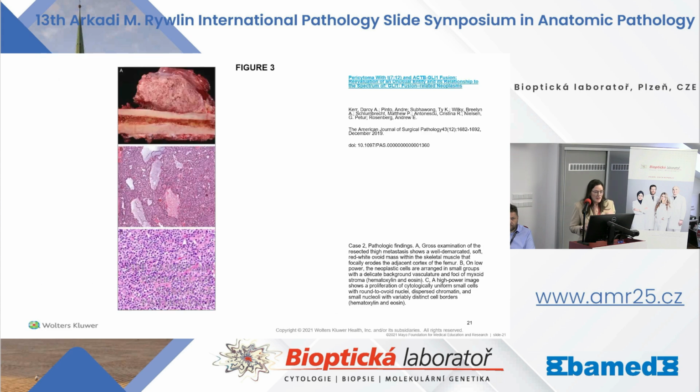This is a tumor in the soft tissue adjacent to bone here. But we can see morphologically it has a lot of similar features to the tumor I showed you in the small bowel: pretty monotonous tumor cells with this rich vascularity.